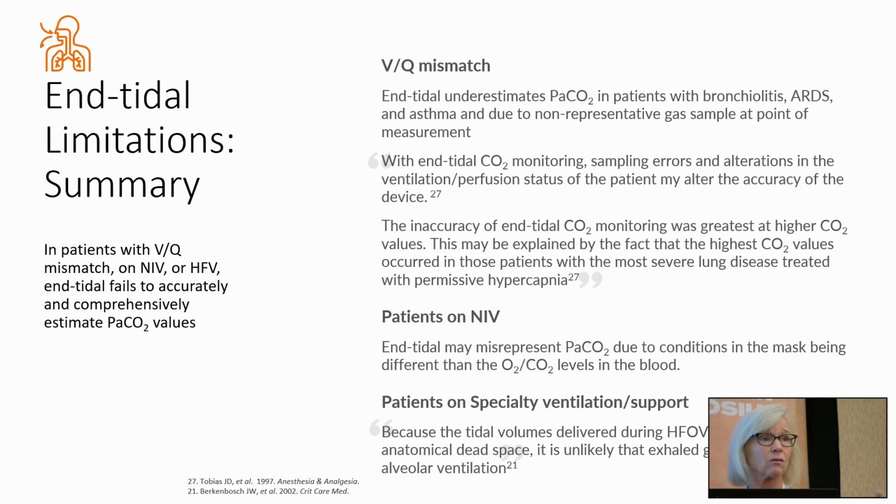end-tidal is great when you have an intubated patient who has relatively healthy lungs, and a lot of times you can use it to trend even if the lungs aren't healthy. But it's got limitations if they have extremely unhealthy lungs, and also if the patient's not intubated. And now that we're managing so many more patients non-invasively, which is a good thing, we need a better alternative to monitoring their CO2.